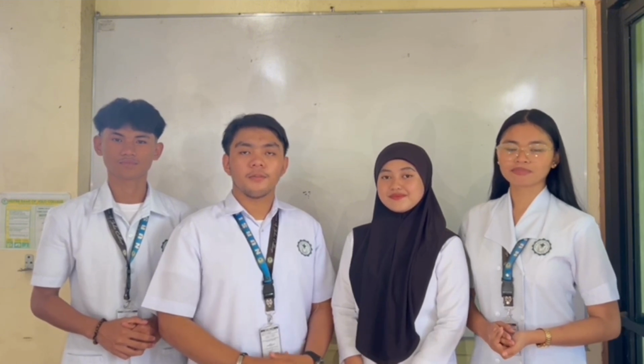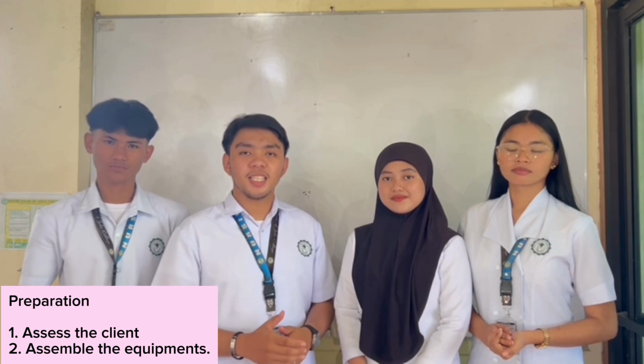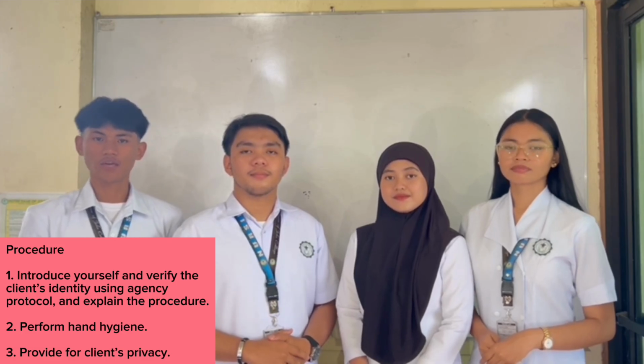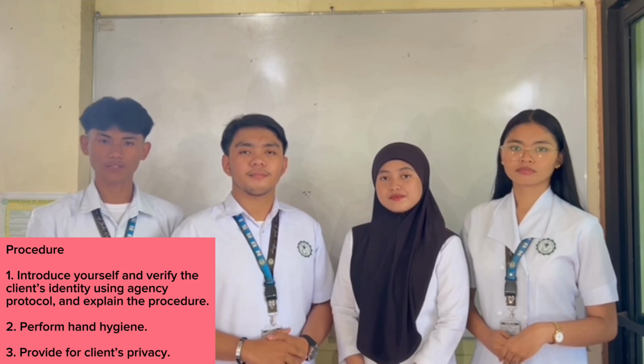As nurses, to measure the blood pressure of a person or client appropriately, we need to follow the step-by-step preparation and procedure in order to have accurate results. For the preparation, the first is assessing the client. The second is assemble the equipment. Going to the procedure, number 1, introduce self and verify client identity using agency protocol. Explain to the client what we are going to do, why it is necessary, and how she can participate.